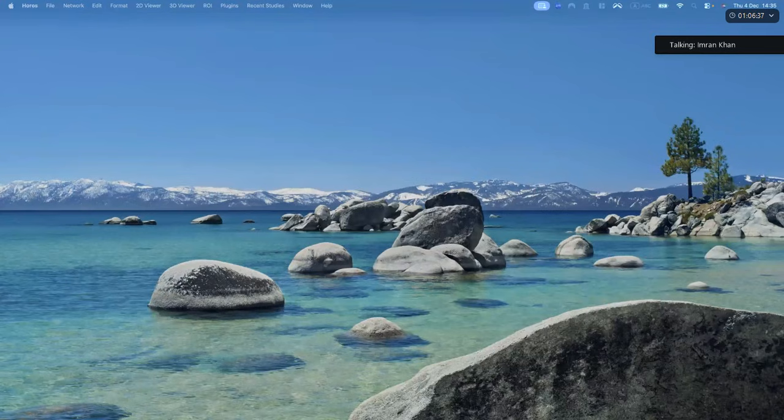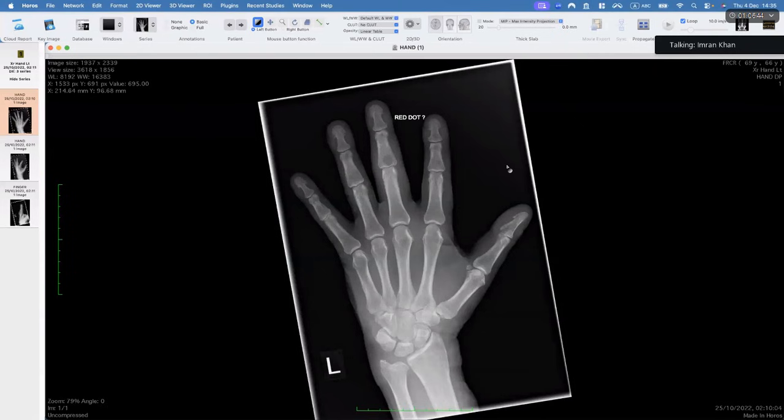The second one, again, one of the things that I would say is, the way I went for my Vivas, right? If I was 100% conclusive, for example, I see a case of rheumatoid. Now I know it's rheumatoid, right? There's no other differential for it except rheumatoid. So what I would do is I would say it's rheumatoid, and then I would describe the findings with a lot of confidence. And sometimes I would say there's this, and that, right?